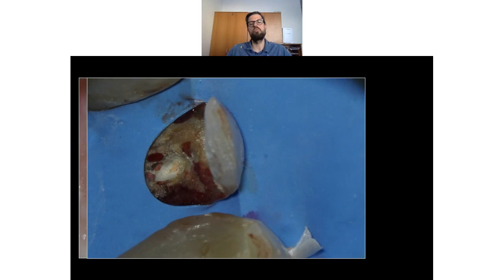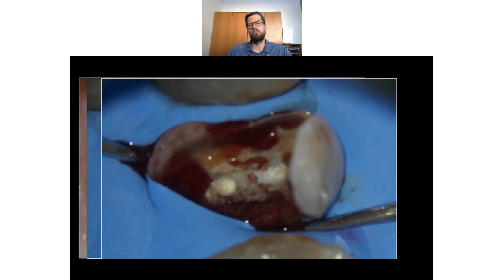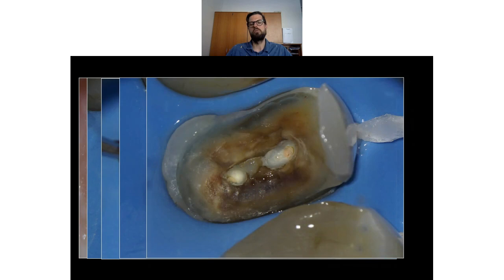through the tooth. You will need, for example, two or three probes, because one holds the assistance, one holds you, and maybe a third one is necessary. And now you are trying to get the secondary isolation, and then it looks like this. So now it's good, but now you have to put a ligature there. You just take your ligature and put it on the tooth. It is even tighter in the cervical area.